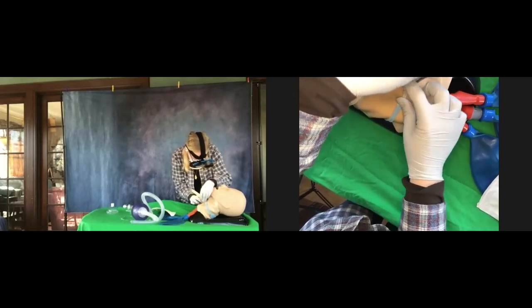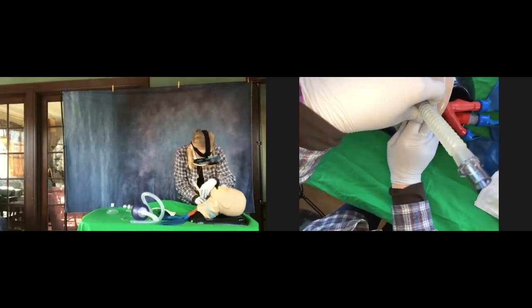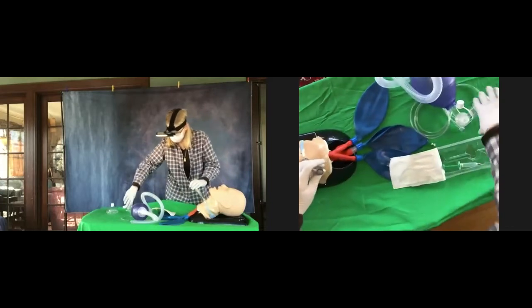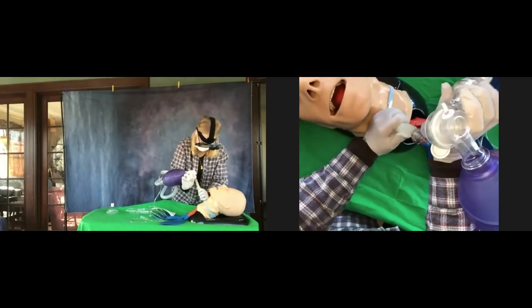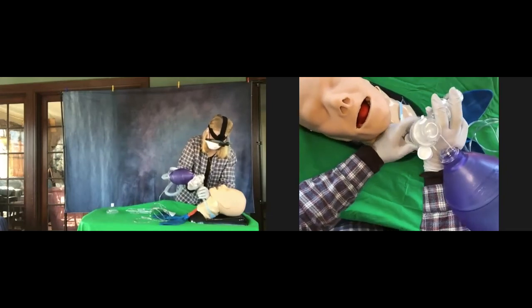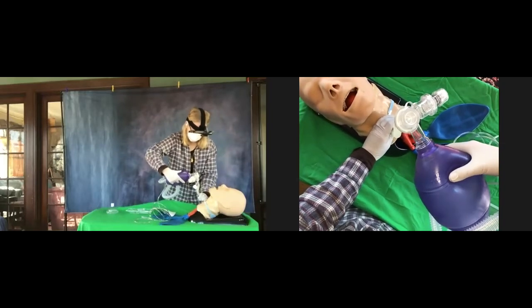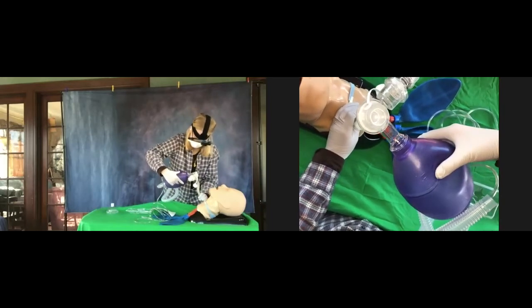If you're struggling with it and can't get it, take a little break and do some bag valve mask ventilation. Looks like you got it — go ahead and hook up the bag valve mask and ventilate the patient. At this point you would listen to the lungs on both sides with a stethoscope. Well done.